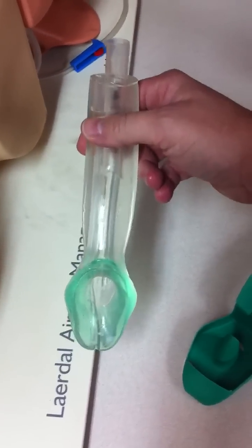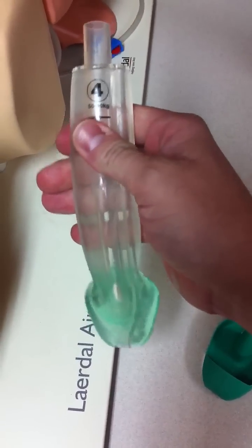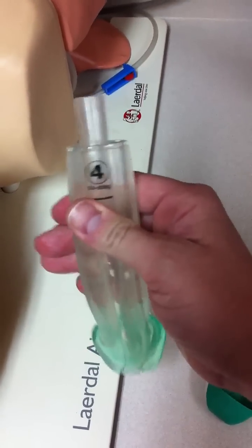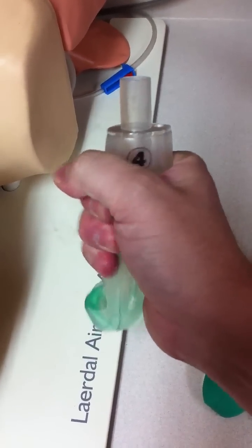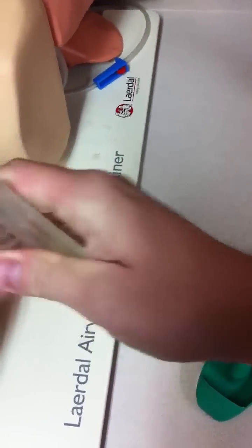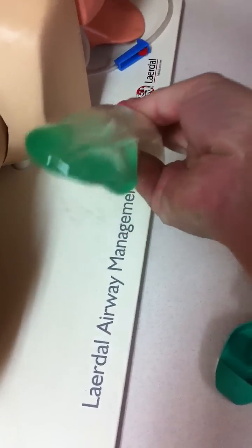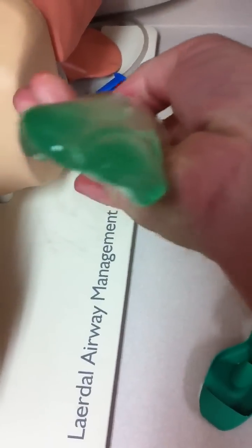It has a very similar construction to the LMA, with a couple of different exceptions. The first is that it has a very hard bite block area here, so the airway is not obstructed by the teeth or by biting. It also has a little port here that allows you to pass a gastric tube.